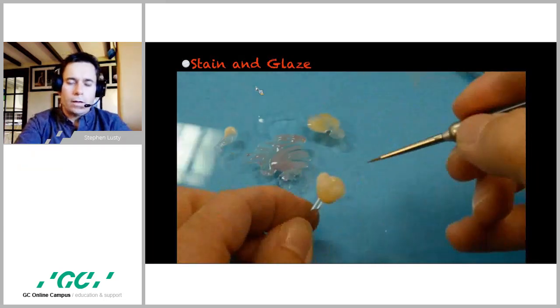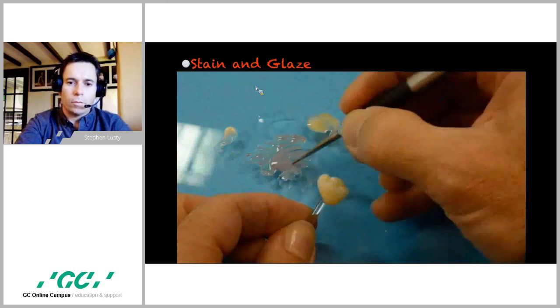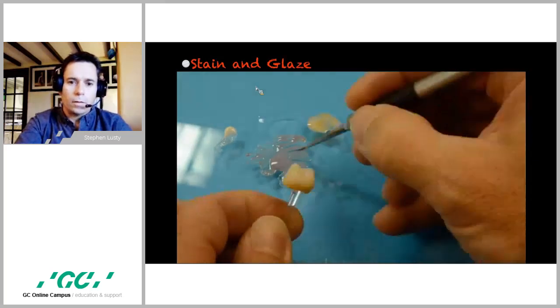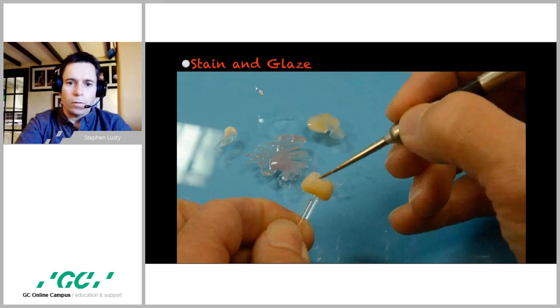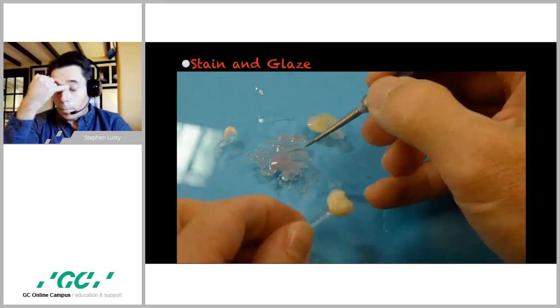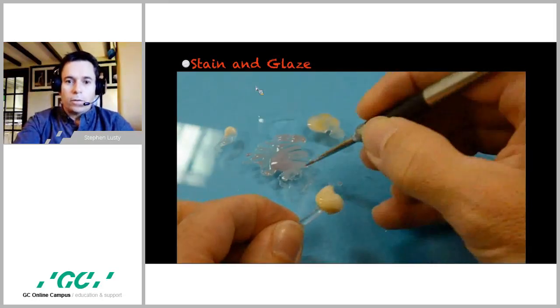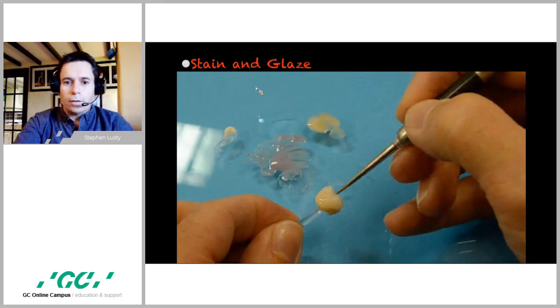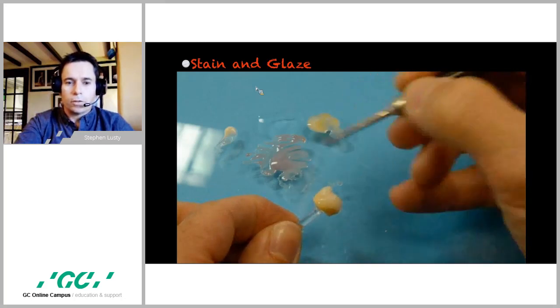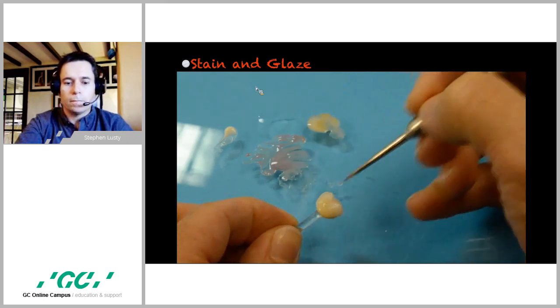I know there was another mixture for incisal going around a while back, you can still see it online, with the blue, the grey and the white. Now I found that worked really well for the blue shades, but I didn't really like it for darker shades, so I developed this mixture rather. That seems to work better for me for pretty much everything.